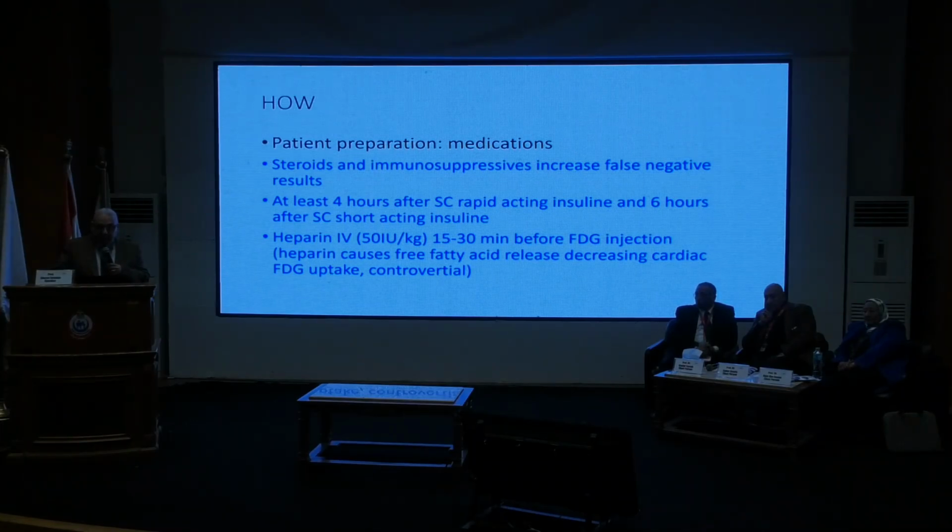Some studies have suggested that we should give heparin IV 15 to 30 minutes before FDG injection. This will lead to increased release of fatty acids in the blood and will decrease myocardial uptake of glucose. This is controversial. Some people say that it should be done, as it leads to a proper image, and some people say it's not important and we do not have to do it. So it's controversial.